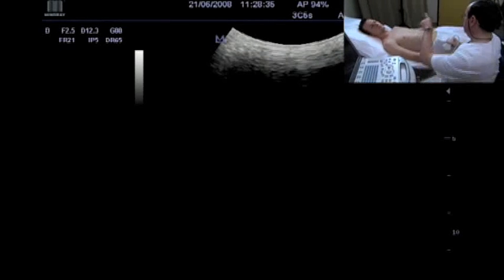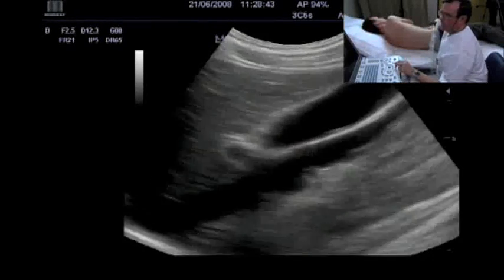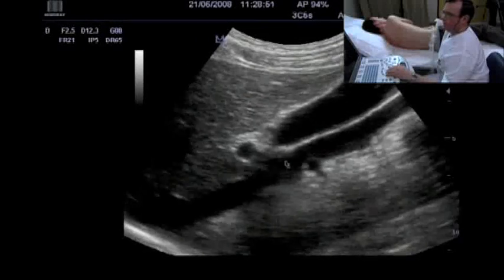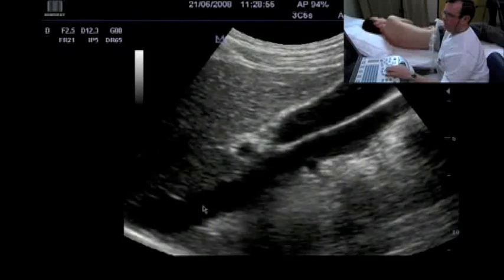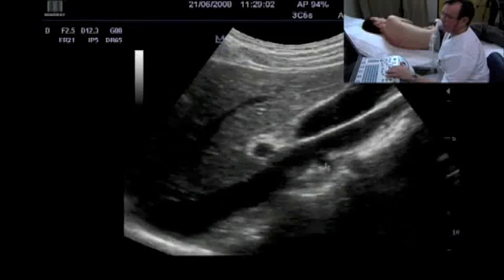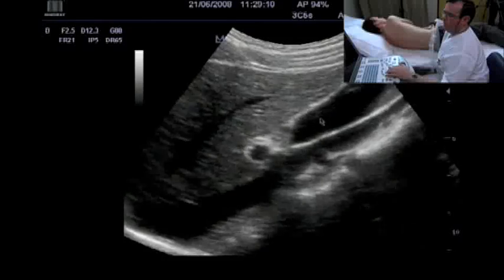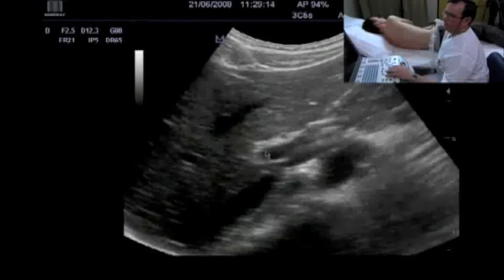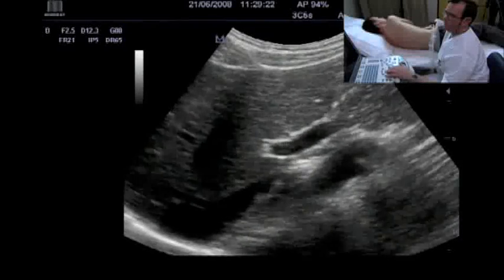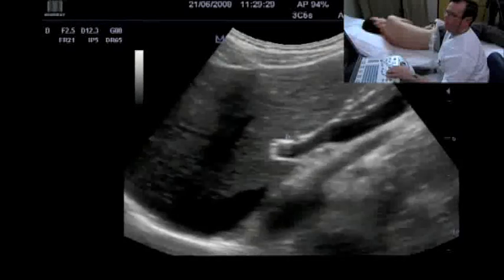We ask the patient to move to the left side and perform a subcostal examination — this is the ideal position to visualize the liver hilum. What we can see here is the caval vein with the cross-section of an artery, which is the right renal artery running behind the caval vein. Here is the gallbladder and the different structures of the liver hilum: the portal vein, the main bile duct, and a tiny vessel which is a branch of the hepatic artery.